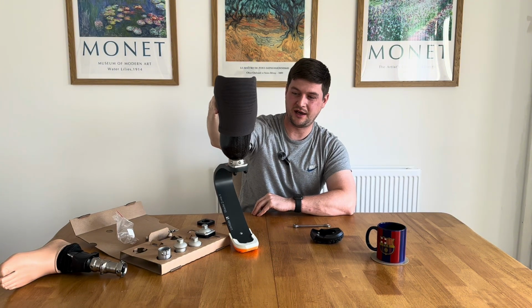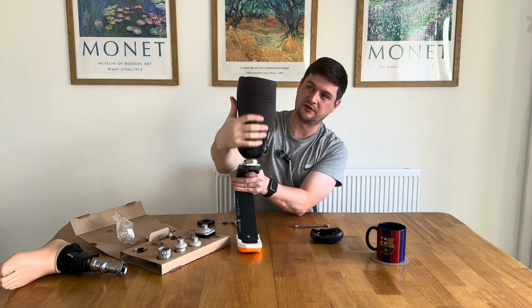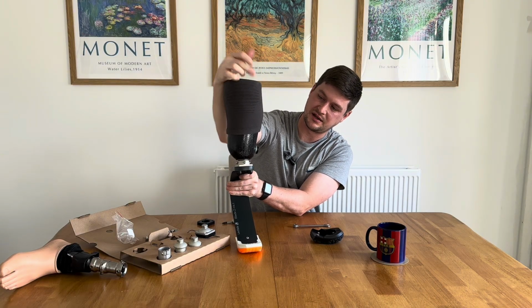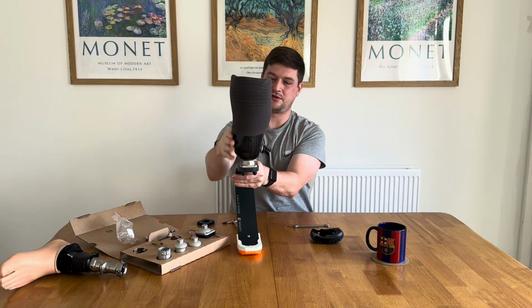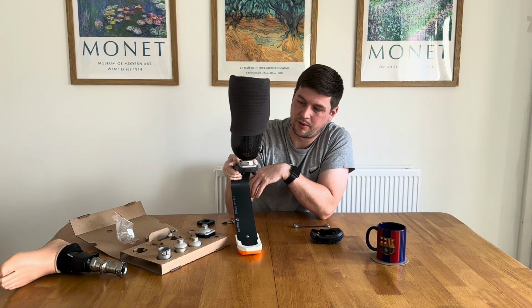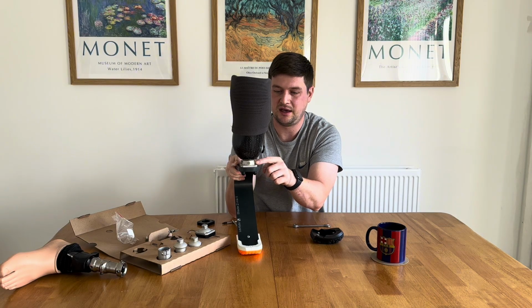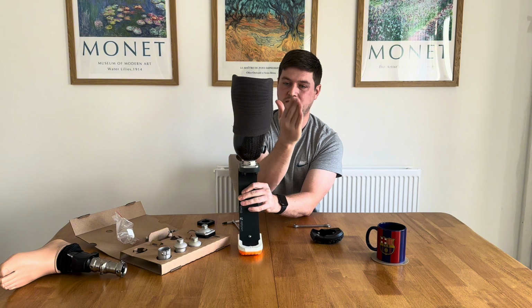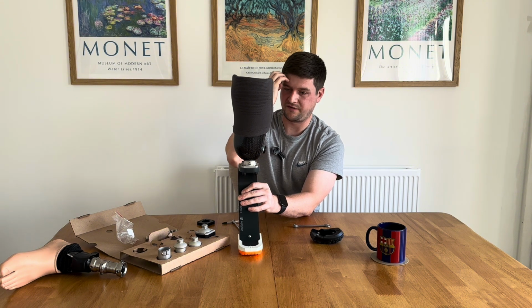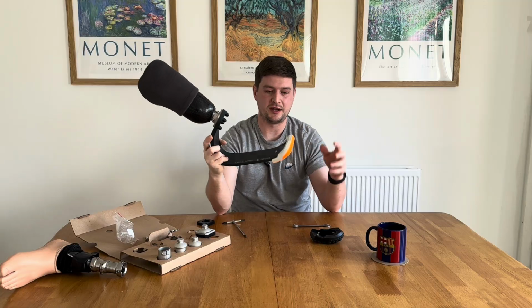Just got to try it on now and hope that it fits, because this is basically a mould of my leg. So there's the lip of my knee, this is the front of my shin. It's all specifically shaped, so I have to make sure it fits proper. But if it doesn't quite fit, if it's not at the right angle or anything, I just adjust them bolts that I have done, and that'll adjust the angle that this socket faces. But yeah, as I say, I'm going to start using this. I'll go and try it on now.